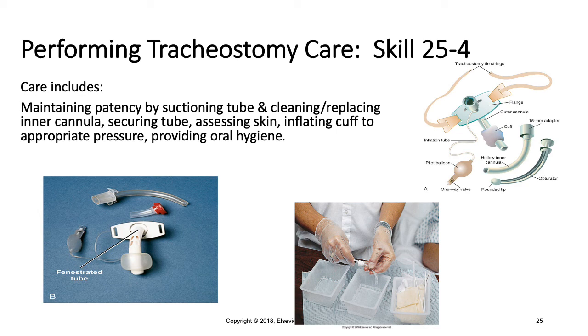Tracheostomy care is another skill that you will do. Usually you will provide tracheostomy suctioning first and then provide tracheostomy care afterwards. This includes cleaning or replacing the inner cannula, securing the tracheostomy tube itself with ties or commercially prepared Velcro holders, assessing the patient's skin around the stoma, inflating the cuff to the appropriate pressure, checking cuff pressures, and providing oral care for the patient. This is a skill that I will demo for you in the lab.